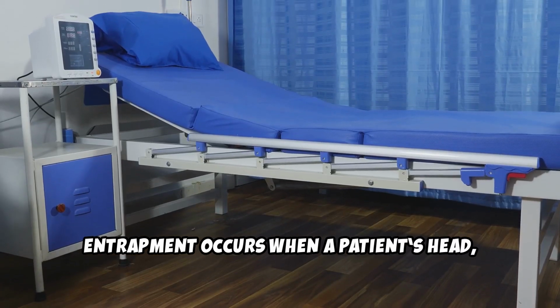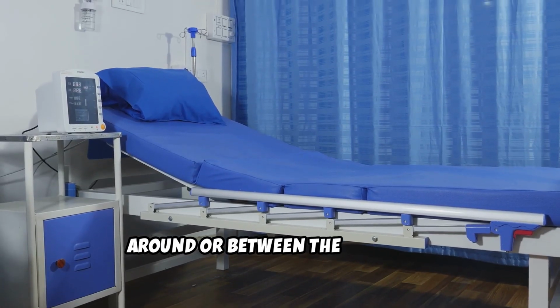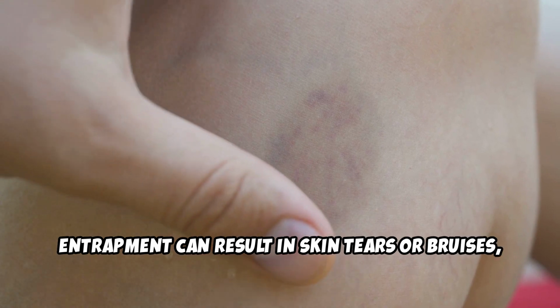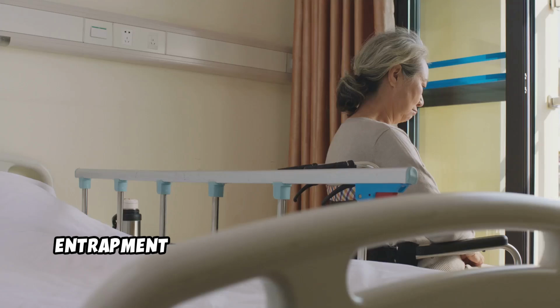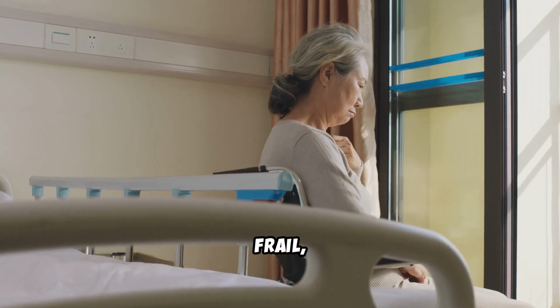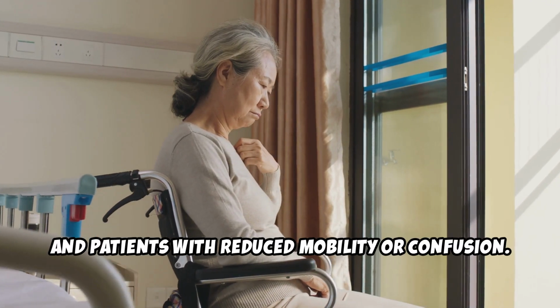Entrapment occurs when a patient's head, neck, chest, or limbs become trapped in openings around or between the bed rails, mattress, or bed frame. Entrapment can result in skin tears or bruises, breathing restriction, strangulation, or even death, especially in frail or confused patients. Entrapment is most dangerous for older adults, patients with dementia, small, frail, or restless individuals, and patients with reduced mobility or confusion.